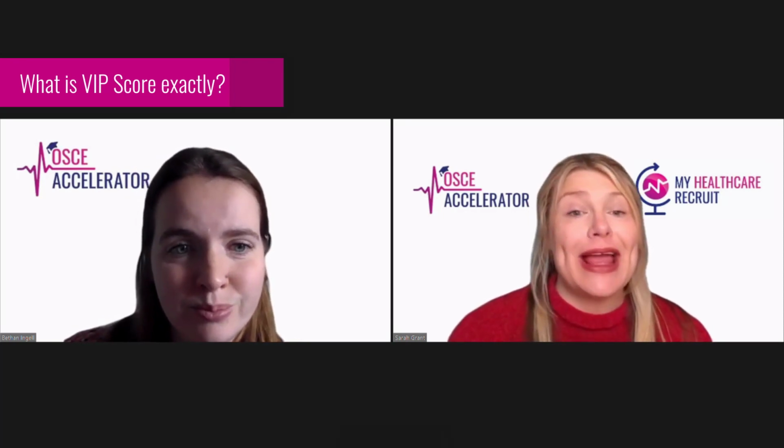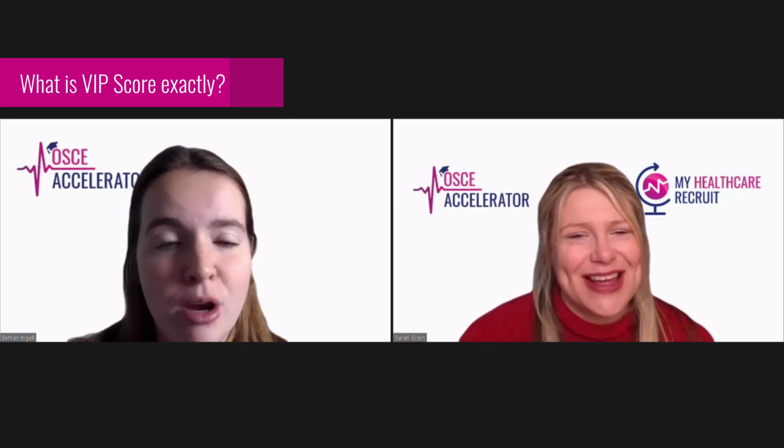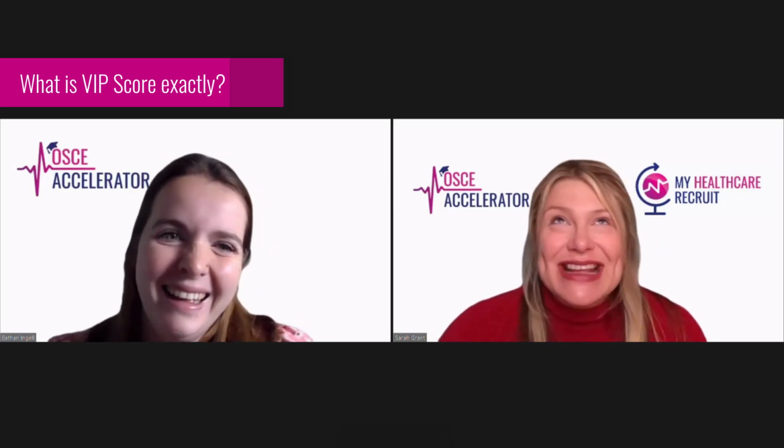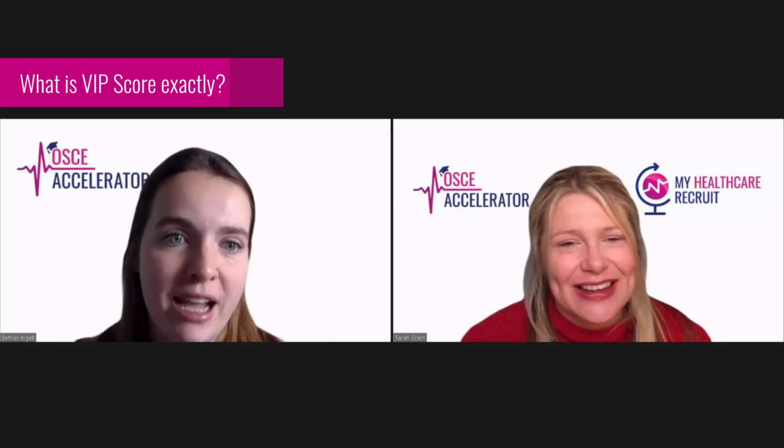Wonderful. Can you tell me a little bit more about this VIP score and what's required? Yeah, so if you haven't come across it before, I would recommend looking it up, but don't spend too much time on it. It's not as important as some of the other things for your exam. It stands for Visual Infusion Phlebitis Score, and it's a scoring system used to assess cannulas and their risk for phlebitis. It's a funny one, that one, isn't it? A mouthful. Phlebitis. Yeah. It also gives you some advice on what to do if your cannula looks infected, like when to stop using it, when to resite it.